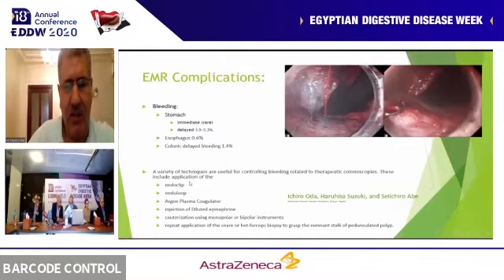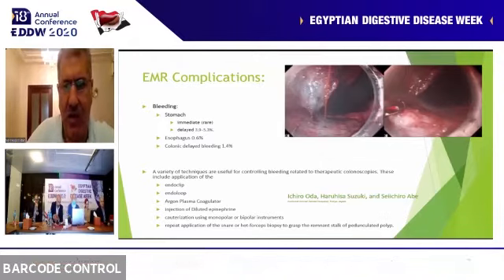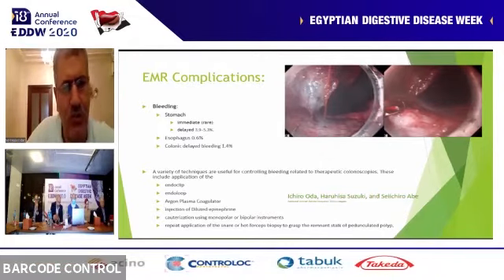Now, you control bleeding like many other areas, like our colleague just a second ago showed us an excellent way to control bleeding. The most common way we do this is either by clipping, which especially if you see a vessel, or by actually cautery. Now, if it's an ooze, argon plasma coagulation is really excellent for that.